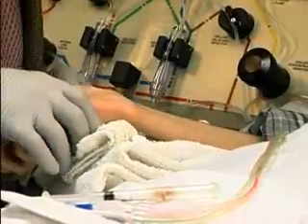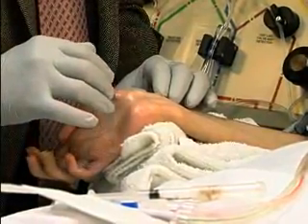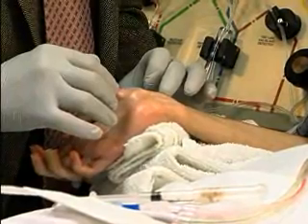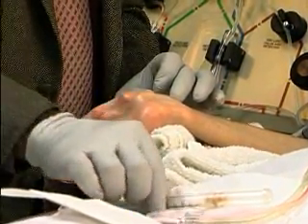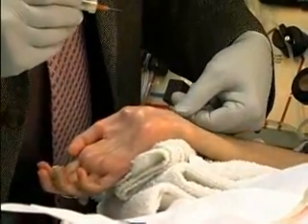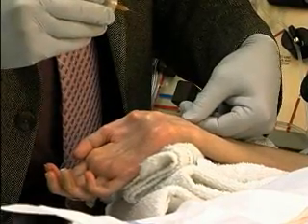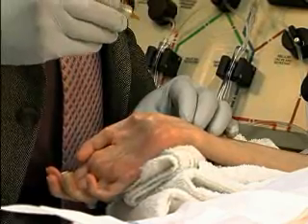The important thing is to position the wrist so that the wrist is slightly hyperextended, and you can fill the radial artery quite well. What I do is I'm right-handed, so I fill the radial artery with my left index finger and the middle finger.